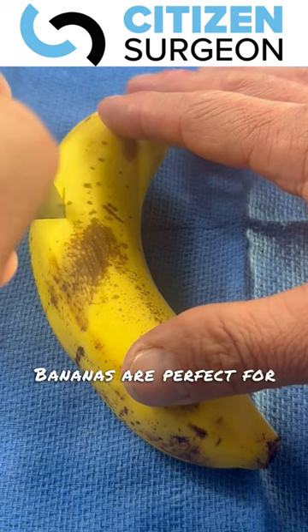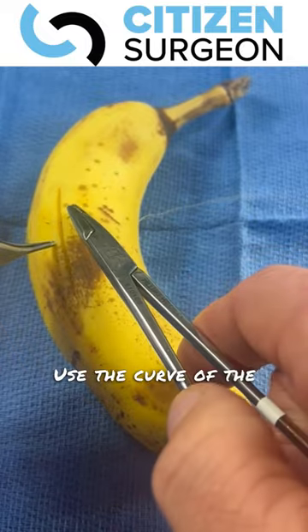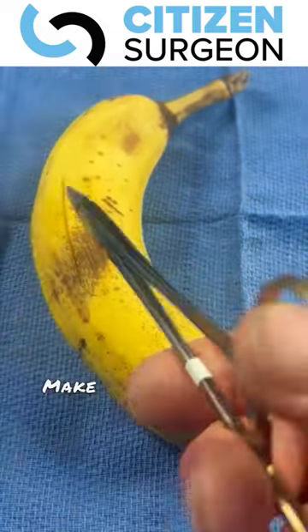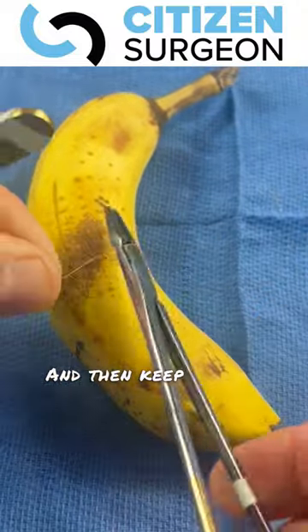Bananas are perfect for this. Make a small incision in it, then take your suture. Use the curve of the needle — do not rip it through the banana, try to preserve that. Make some nice knots, clip them with the scissors.